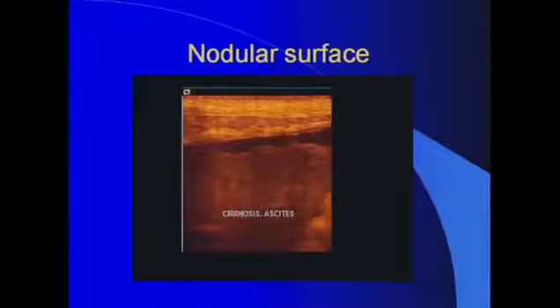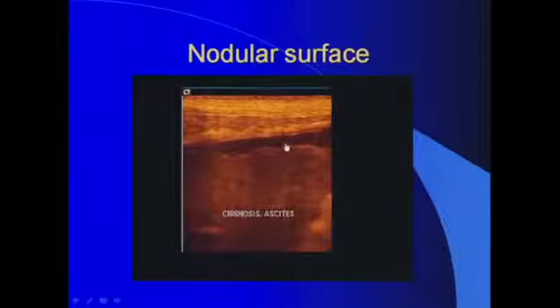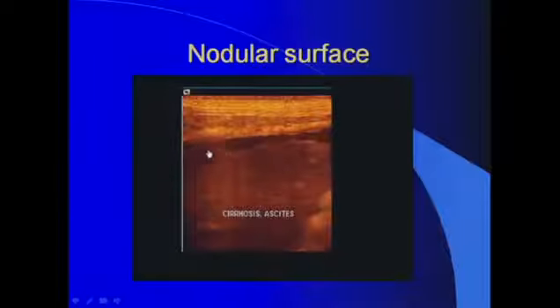This is a high-resolution ultrasound using a linear probe evaluating the left lobe of the liver. Now, this is a straightforward example because, look, in the presence of ascites, your specificity and sensitivity significantly improve. You can see how irregular this liver surface is, indicative of cirrhotic change in this patient with chronic hepatitis.